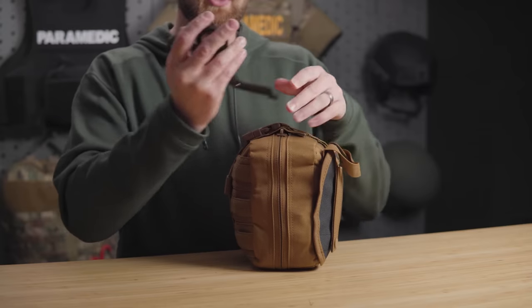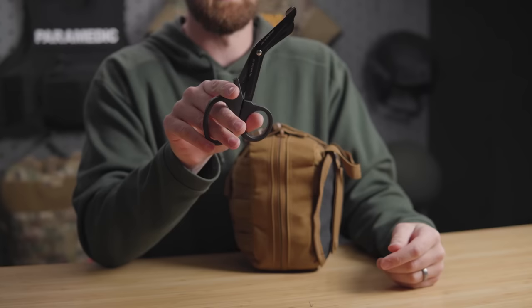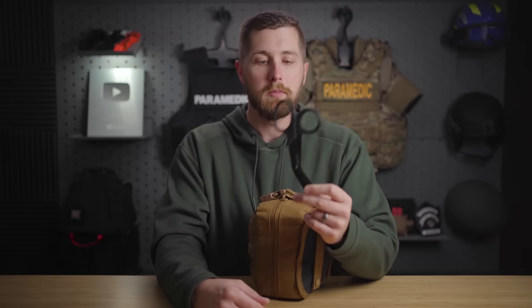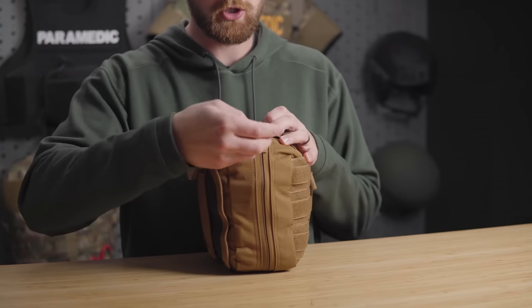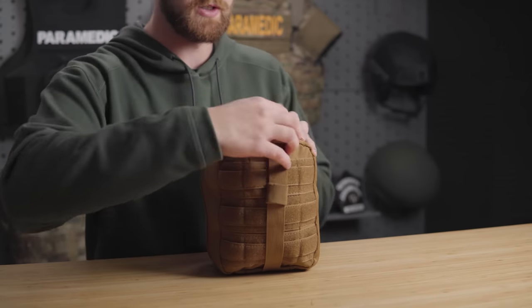Moving on to the kit itself. Out here we've got some trauma shears. These are a little bit higher quality than your basic $2 shears, but nowhere near your XShears or Raptors. These will work one or two times before you have to replace them, which is really what they're intended for — just a quick use since you're hopefully not cutting people's clothes off on a regular basis as a civilian. The kit itself is Cordura nylon, very sturdy. The zippers are huge with two-finger pull tabs; these things aren't going to break or wear down.